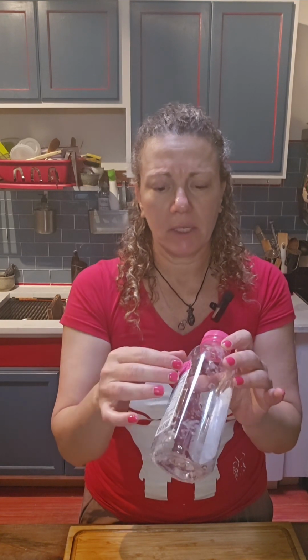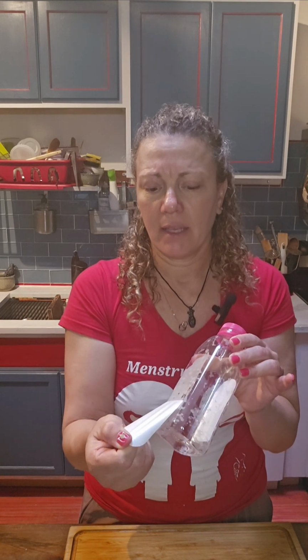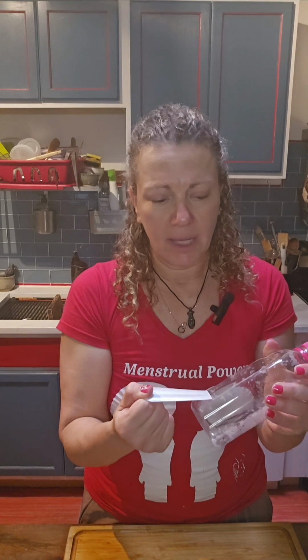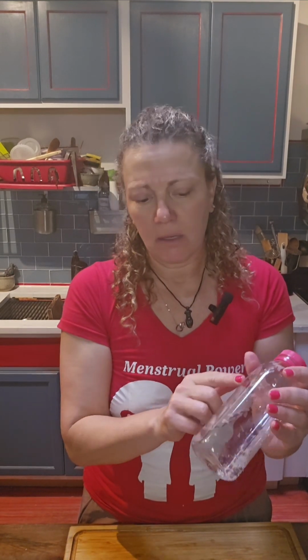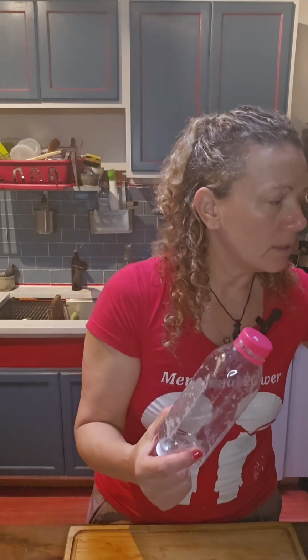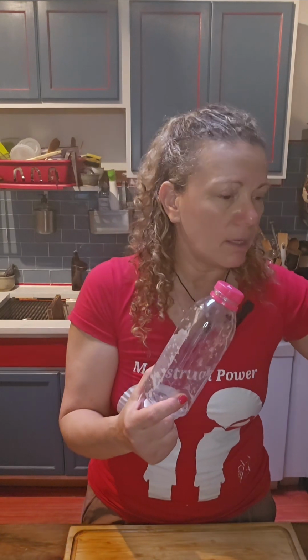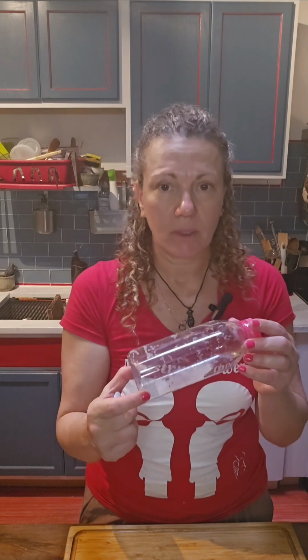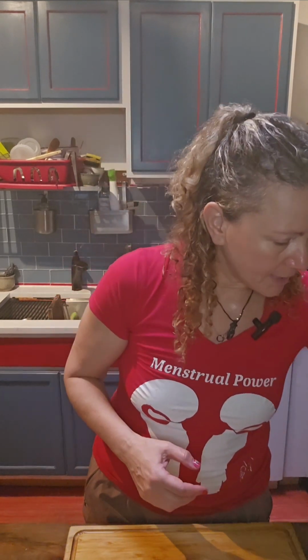The fact that it's rectangular doesn't really matter. You pour a little bit of hot water here, and then you can peel the label very easily, and almost nothing remains, like this. And if this is not clean enough or transparent enough, you can use some nail polish remover to take the remains of the label off the bottle.